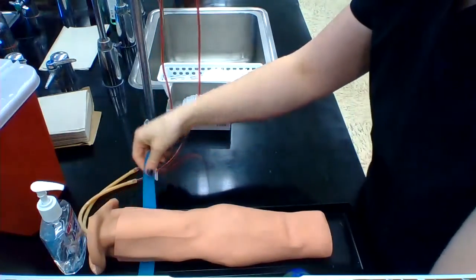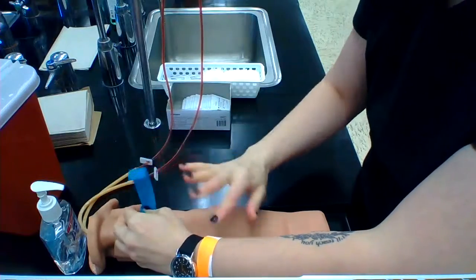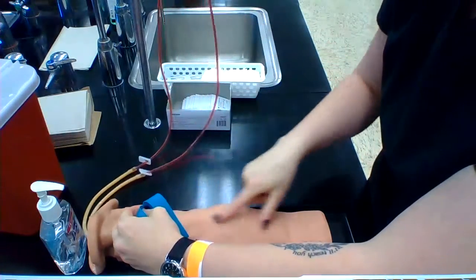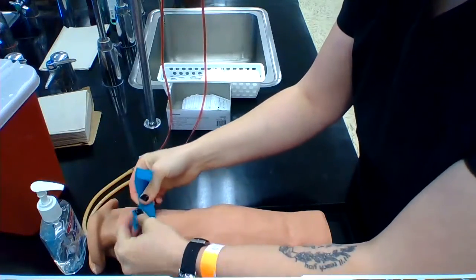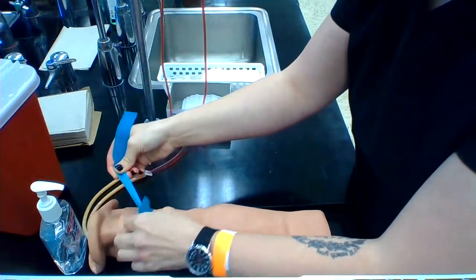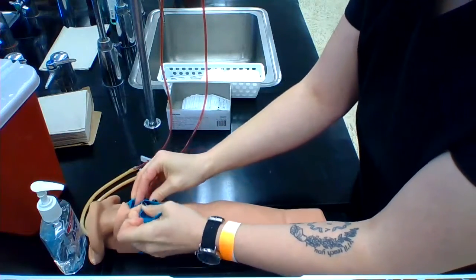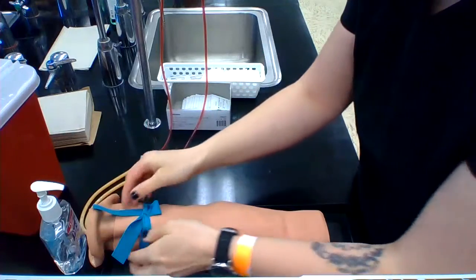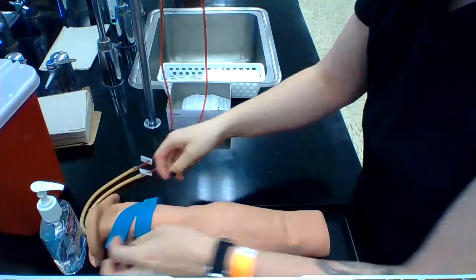You're going to start with tying your tourniquet. I'm not going to actually have this tied during the demonstration because these sometimes won't flow if it's tied, but I'll show you right here. You cross it, and then on the top one you pull it up and over, pinch it with your other hand, take that little bunny ear and tuck it under. You're going to want to ask if it's painful because it can sometimes hurt the patient a bit.